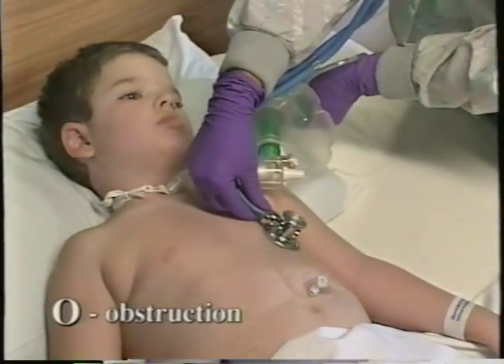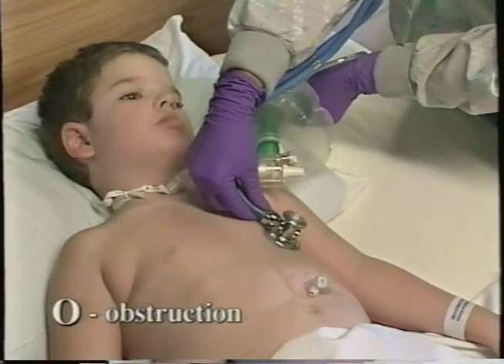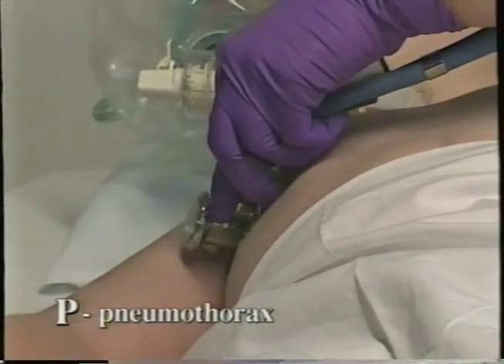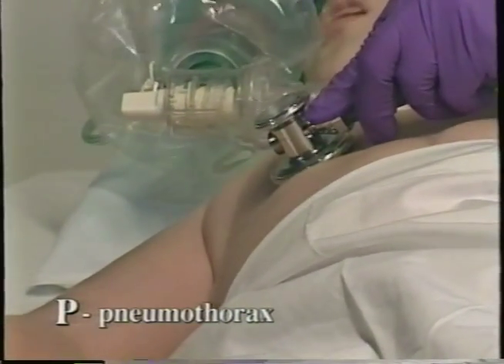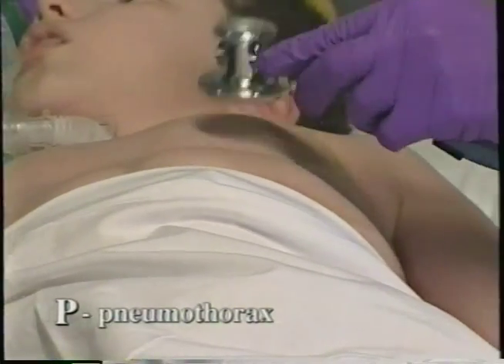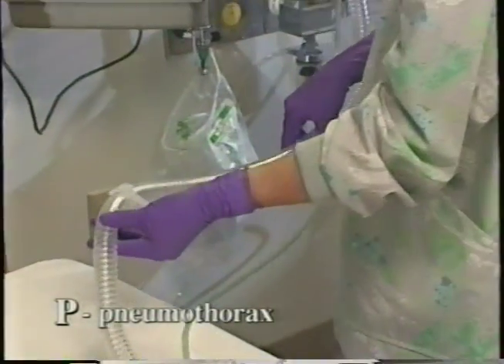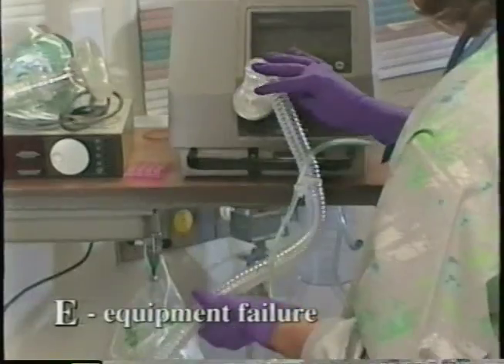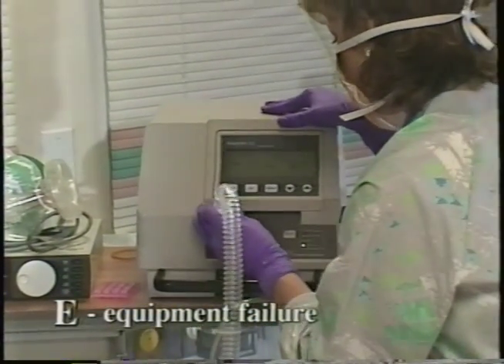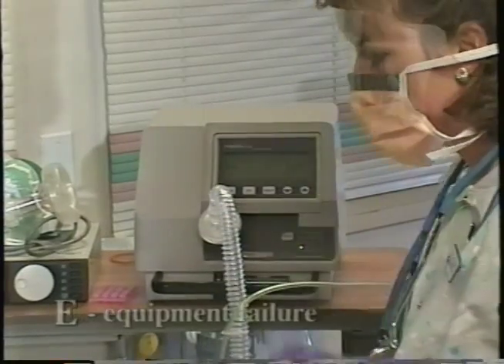Is airflow through the tracheostomy tube obstructed? P is for pneumothorax. Is the child showing signs of a pneumothorax, such as asymmetric chest rise or unequal breath sounds? And E is for equipment failure. Is the oxygen supply intact, equipment connected, and equipment functioning?